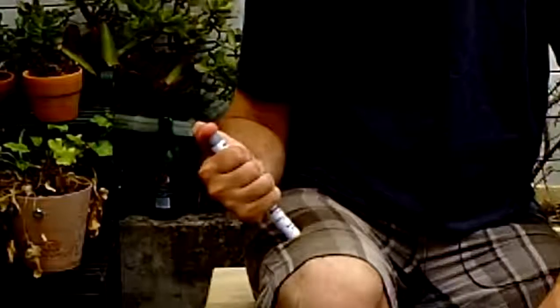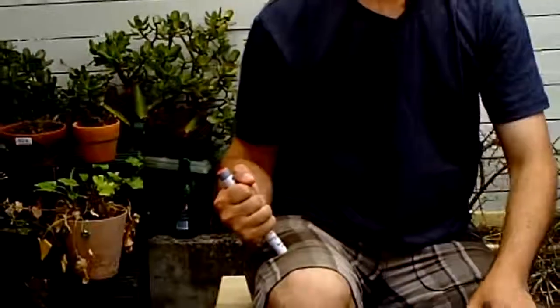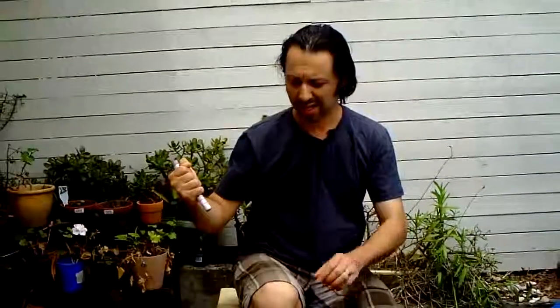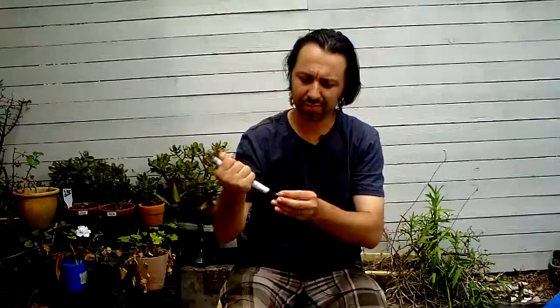You'll hear it click — push down on the red button. That's injecting the adrenaline into the individual. Hold it on there for 10 seconds. Once the 10 seconds are up, take it out and massage the area where the needle was. To dispose of the needle, put the cap back onto the device and you're done.